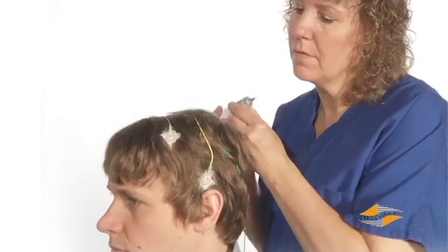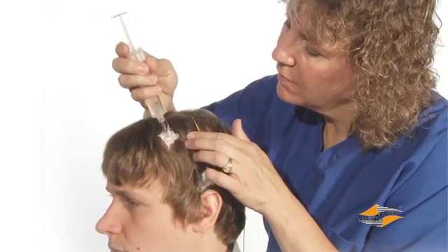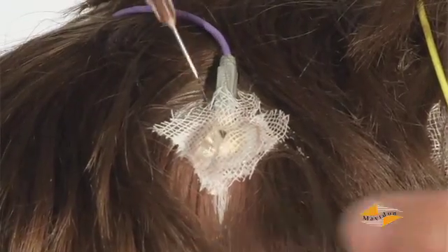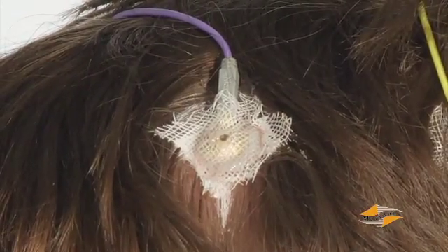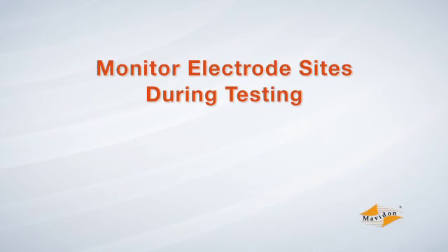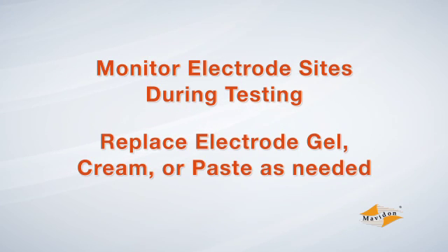Use an electric air pump to blow air over the gauze and speed up the drying process. Once all the electrodes are in place, use a blunt needle syringe filled with electrode gel to fill each electrode through the hole in the dome. Electrode application is now complete. If possible, monitor the electrode sites during testing, as the cream, paste, and especially the gel will dry out over time and need to be replaced.